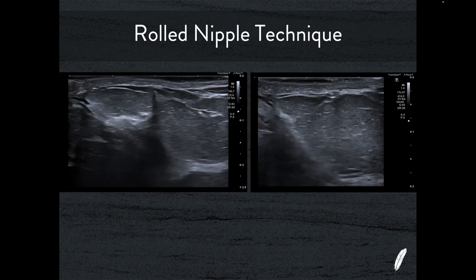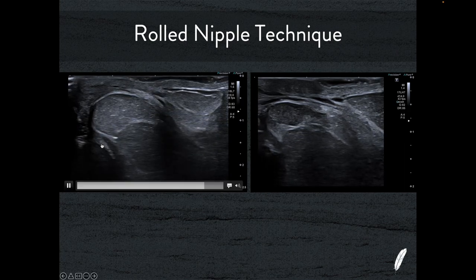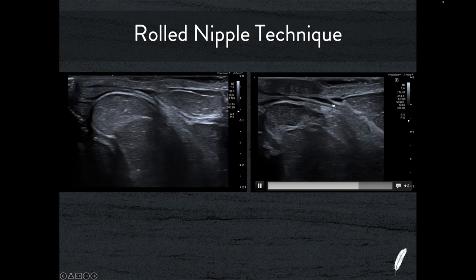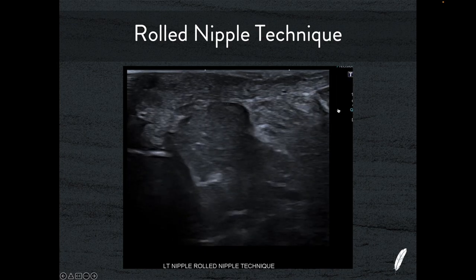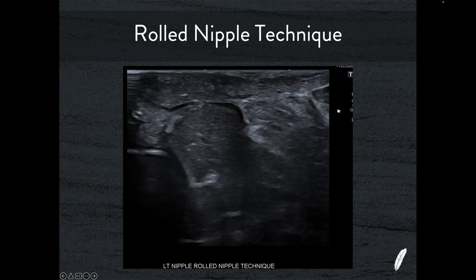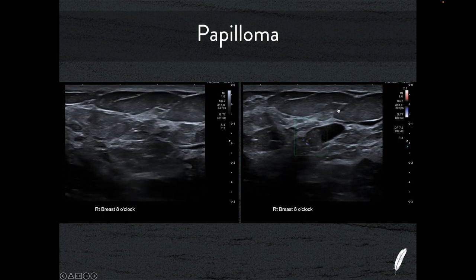If I need to look at the nipple — for a discharge or other nipple-related symptoms — I use what's known as the rolled nipple technique, developed by the wonderful Tom Stavros. Place your index finger really on the edge of the areola margin, then use the transducer to roll the nipple over on top of your index finger, laying the nipple on its side. You can then see beautiful ducts — the walls of the ducts — and if there's a papilloma here it really can't hide. It's called the rolled nipple technique and personally I think it's the only way to go. Even with a fairly flat or retracted nipple, if you take a bit more tissue as you roll it you can still see the ducts underneath.